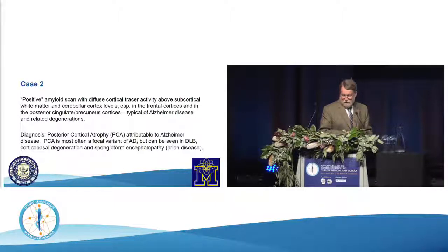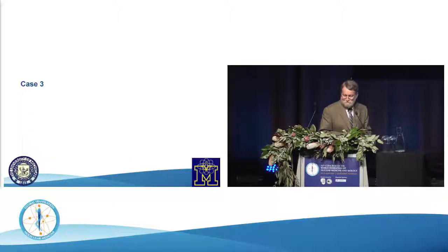So the value here of the amyloid scan is to convince the referring physician and managing physicians that this is a focal variant of Alzheimer's disease, and the existing symptomatic therapies for AD are indicated.